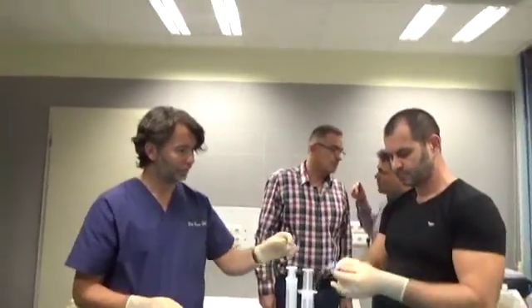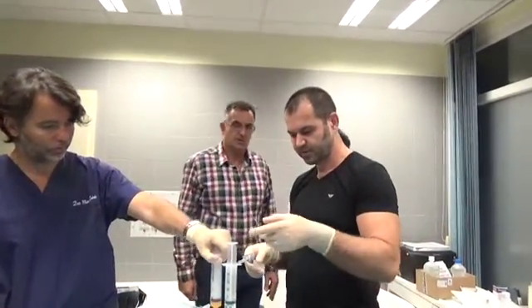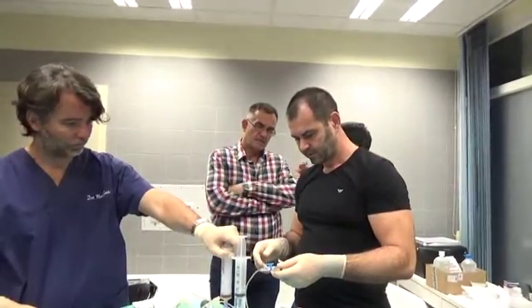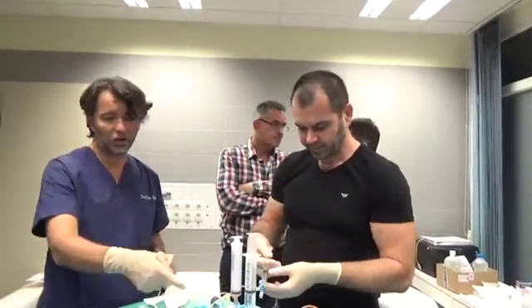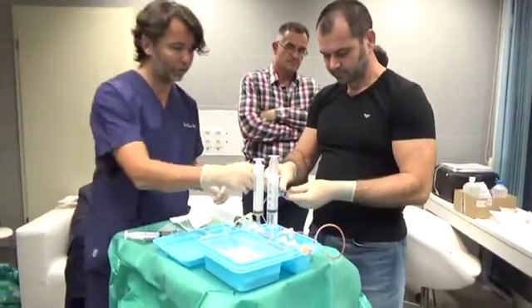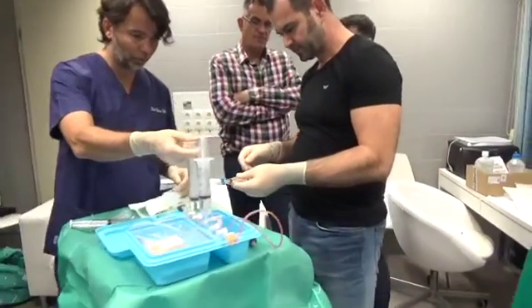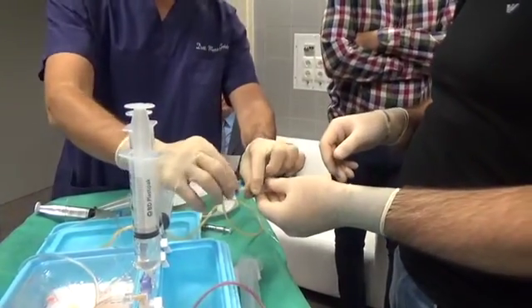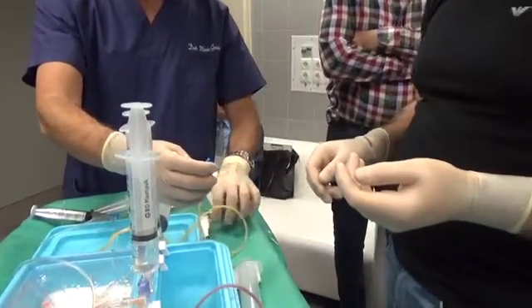Open the system. Perfect, and push. Now I think you can remove the water. Here over air — I think right now we still have some. We can use it to do nano fat, but perhaps a little bit. This one is ok, and then we can connect one syringe.